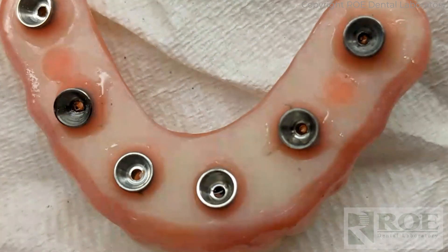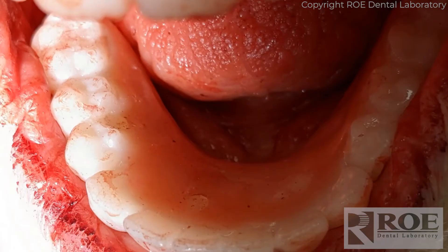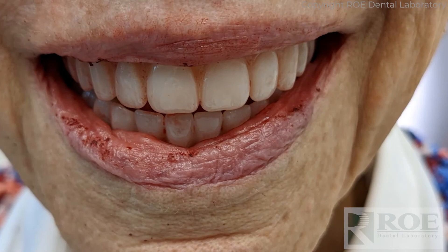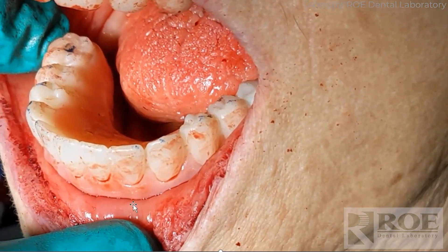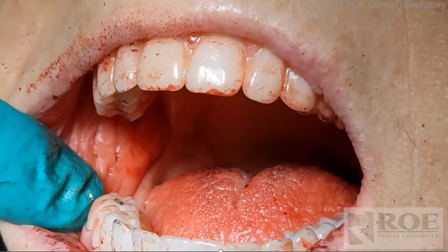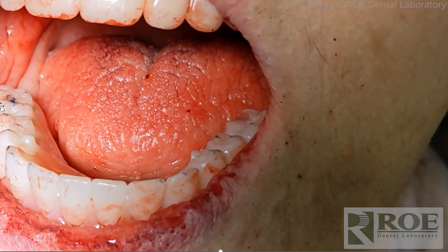Then screw the prosthetic in the mouth. In this case the doctor used a material that needed a light cure, and the case was — as I have seen so many times — literally perfect. There was no occlusal adjustment needed at all. Here's a little video showing the first time we put any indicator in the mouth: you see all the blue marks right where they should be, exactly where they should be. The doctor is going to see the patient in a few days for a little occlusal tap check, as the patient will be in this for maybe three weeks until the tissue settles, and then we go direct to final.